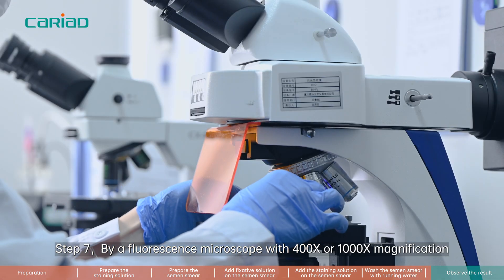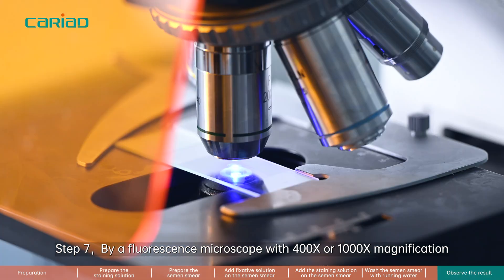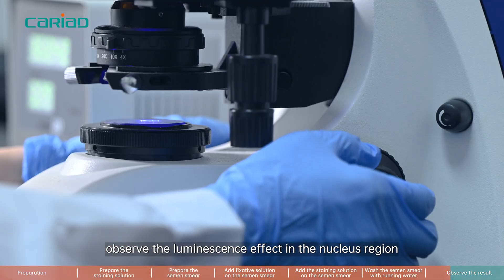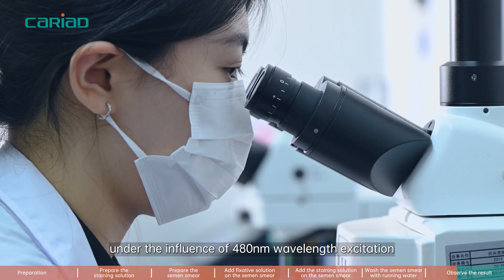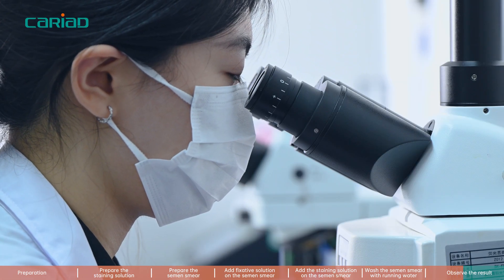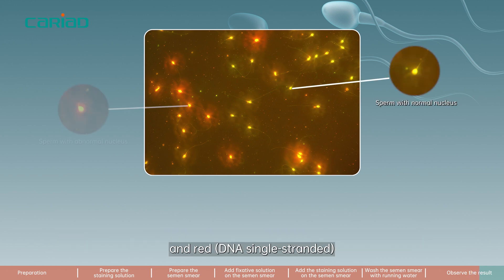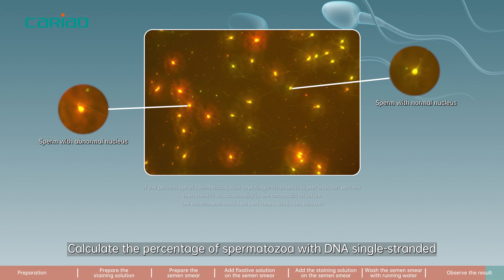Step 7. Using a fluorescence microscope with 400 or 1000 times magnification, observe the luminescence effect in the nucleus region under the influence of 480 nanometer wavelength excitation. Count 200 spermatozoa and detect the ones fluorescent in green and red. Calculate the percentage of spermatozoa with DNA single-stranded.